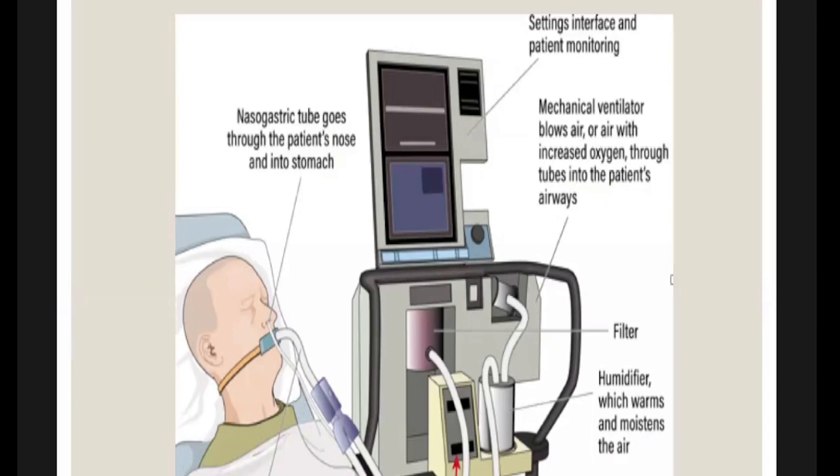Can you all briefly tell me based on what I described already? So if you can start from the patient end, M15094 Sumudu, can you tell me starting from the patient end? Can you please describe what equipment you can see to the patient? So starting from the patient end, what are the equipment you can see up to the monitor, up to the ventilator?